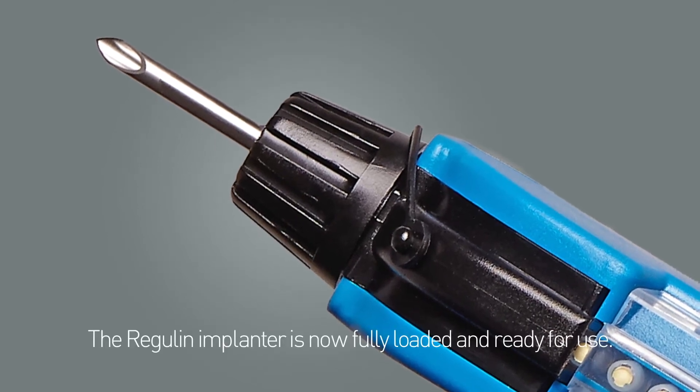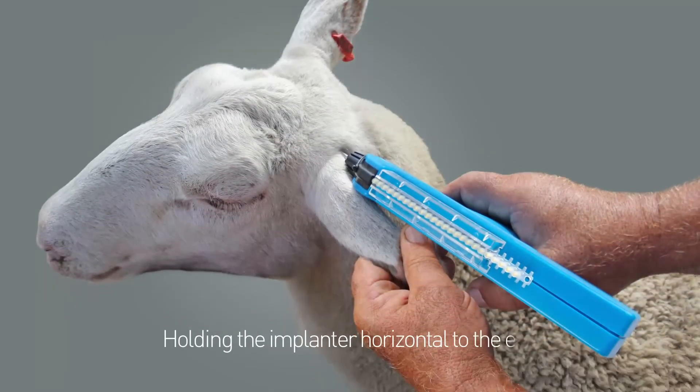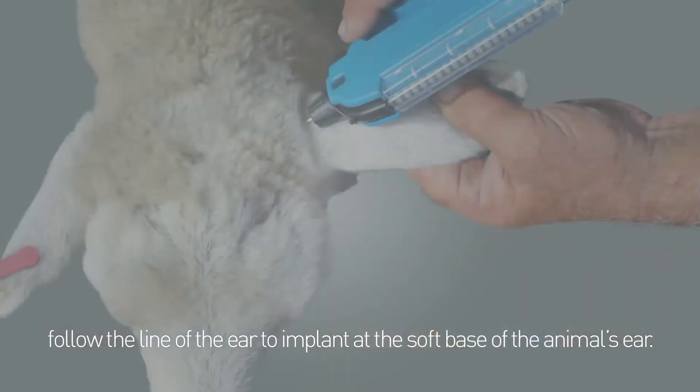The Regulin Implanter is now fully loaded and ready for use. Holding the implanter horizontal to the ear, follow the line of the ear to implant at the soft base of the animal's ear.